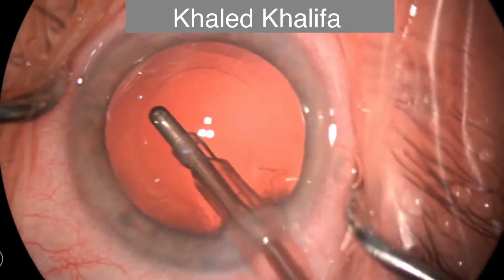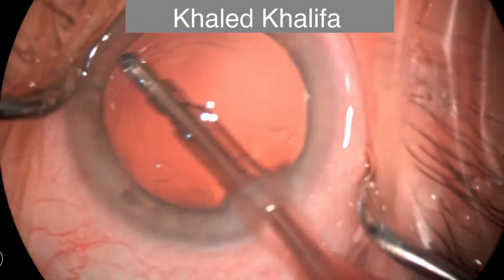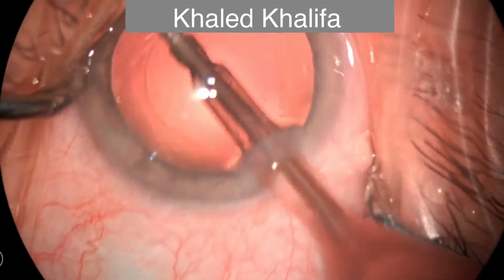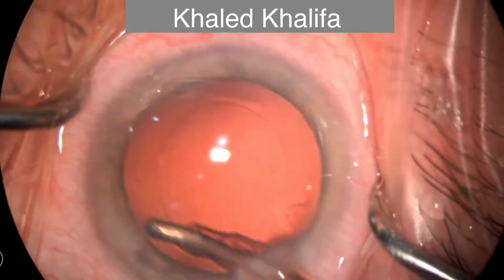As I mentioned, if the anterior chamber is irregular in depth, is shallow and at the same time there is some fluctuation during work, I don't like to elevate the bottle, not to increase the intraocular pressure.